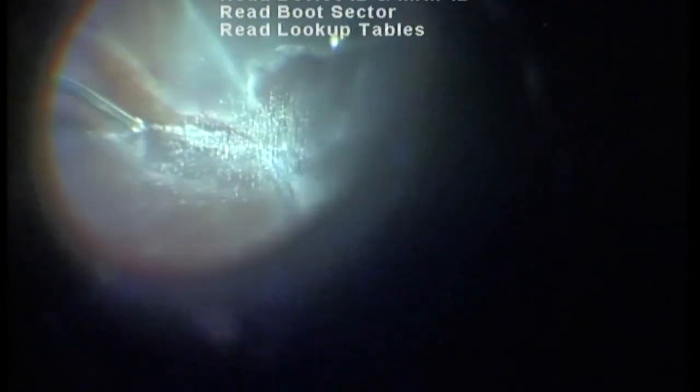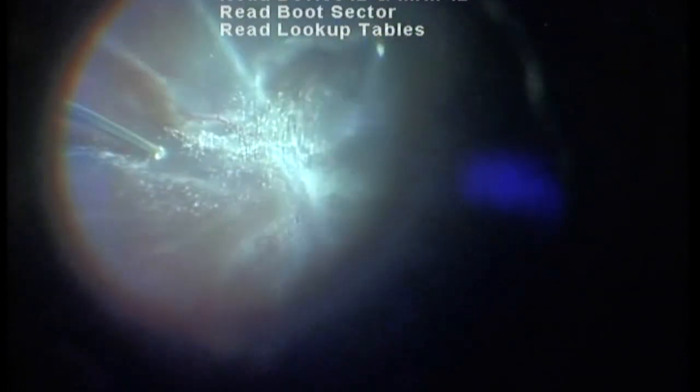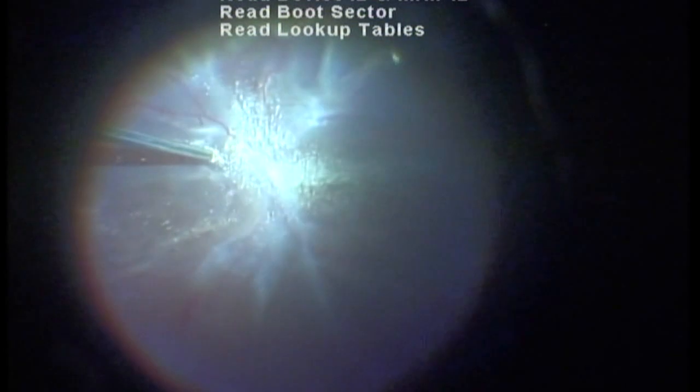In this case, triamcinolone was used to stain the outer layer of the schitic cavity. On removal of the outer layer, the inner layer — which is the true posterior hyaloid — was exposed.